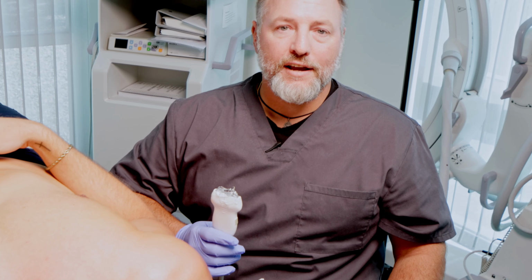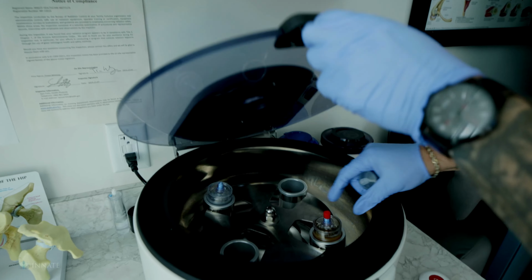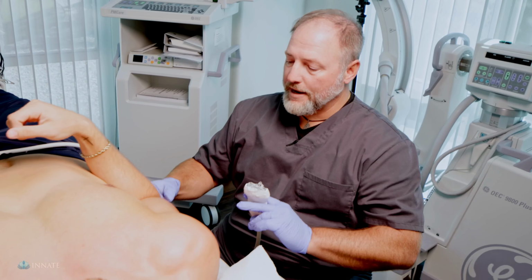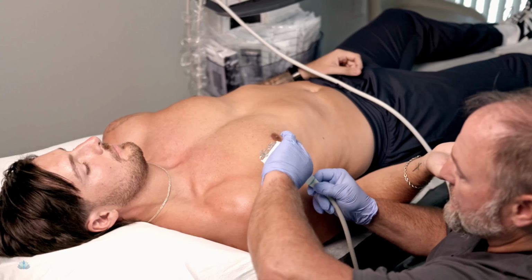Today we're going to be doing a treatment here for the shoulder of the rotator cuff tear. There's a small partial tear from earlier evaluation here that I'm going to be showing and demonstrating. Looking for that pathology and then delivering the treatment to the area here. So I'm going to have the patient here hold their arm next to their body and slowly externally rotate their arm and elbow, because the tear is in the subscapularis area.